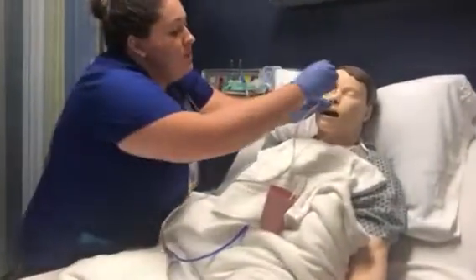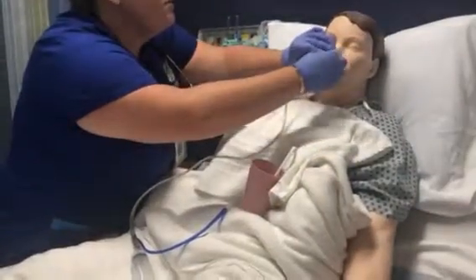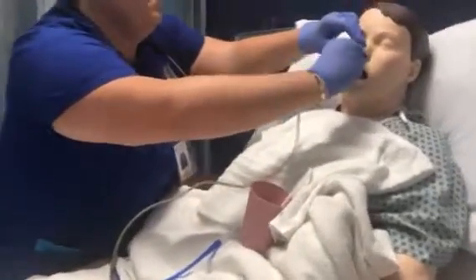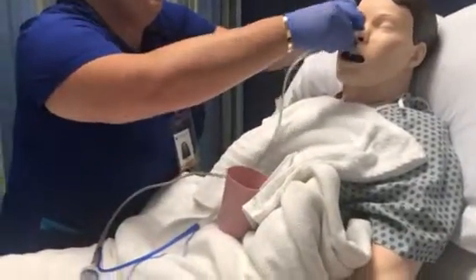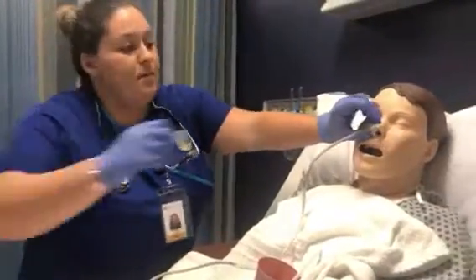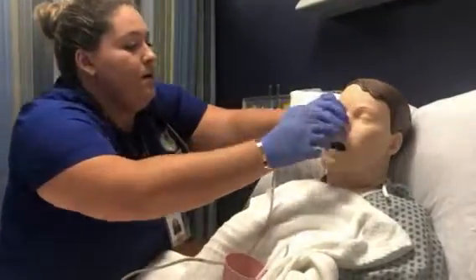Place this piece of tape. And then wrap it around. Okay, wrap it this way. Another piece of tape on top. Okay.